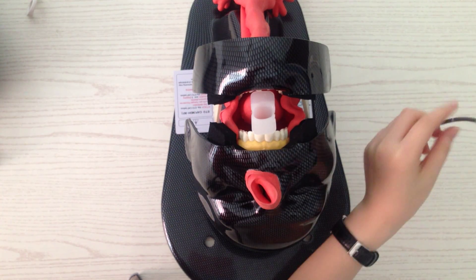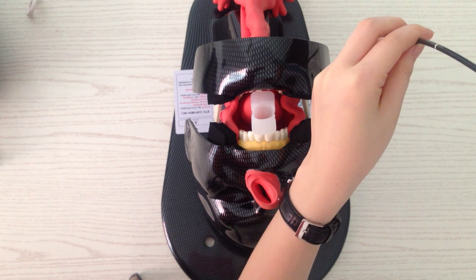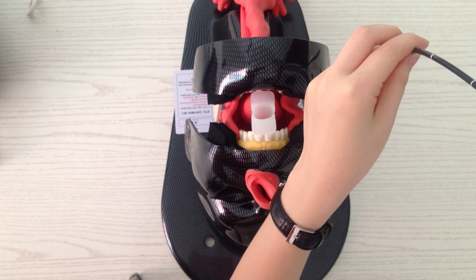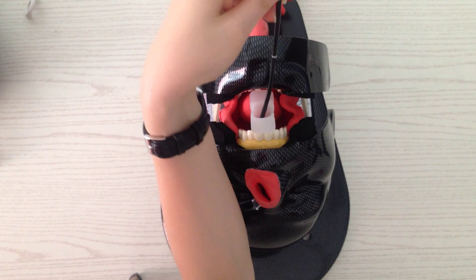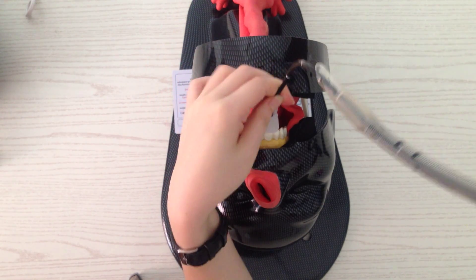Keep the insertion tube straight and the endotube a little forward. Follow the middle line in the guide blade and then insert directly.